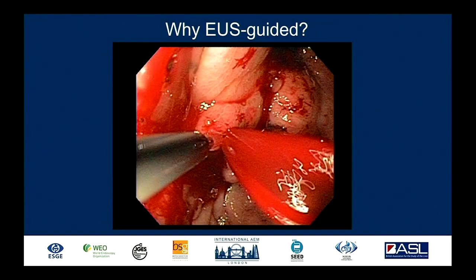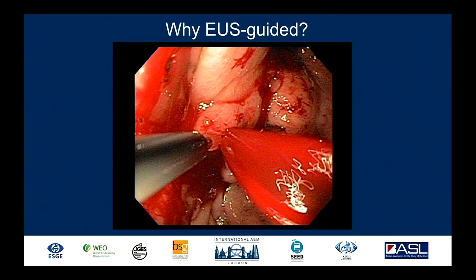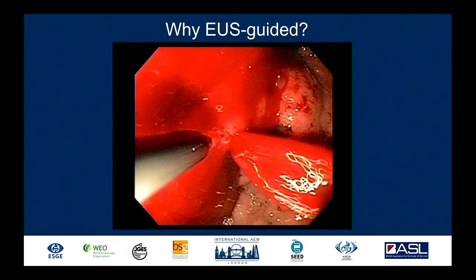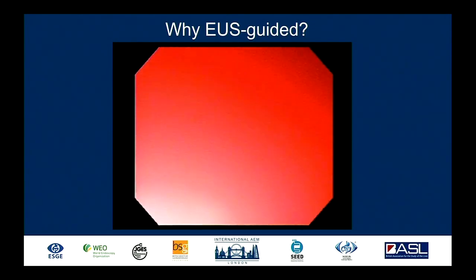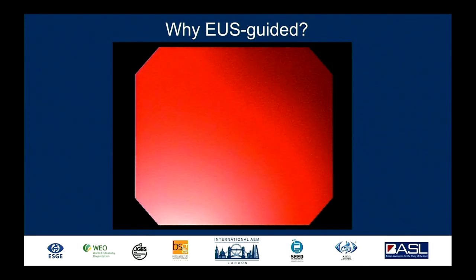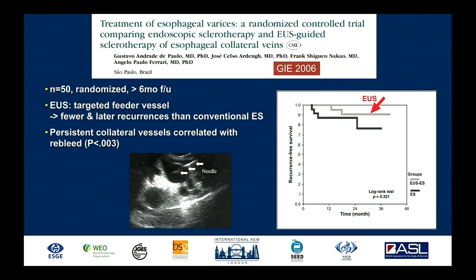This video sums it up very nicely. You can see this exsanguinating, torrential bleed where the lumen is quickly filled with blood — we see nothing. So we can now switch on our ultrasound and target that bleeding varix.